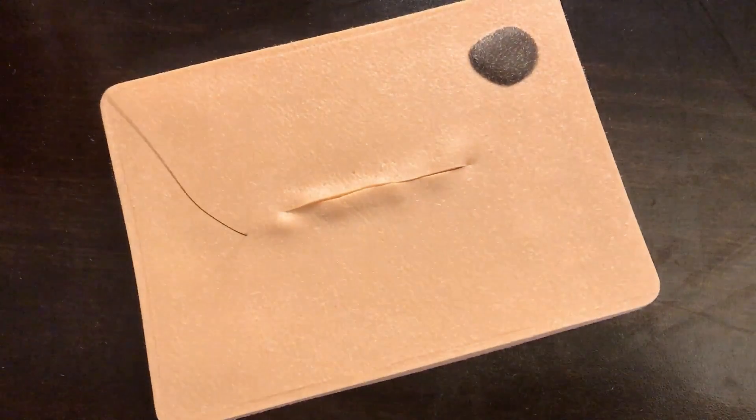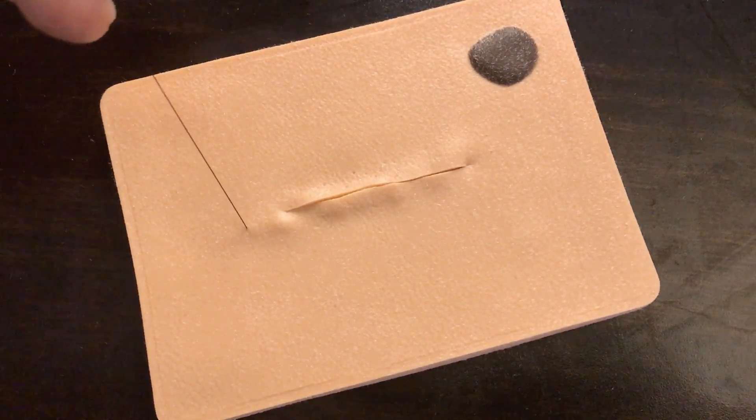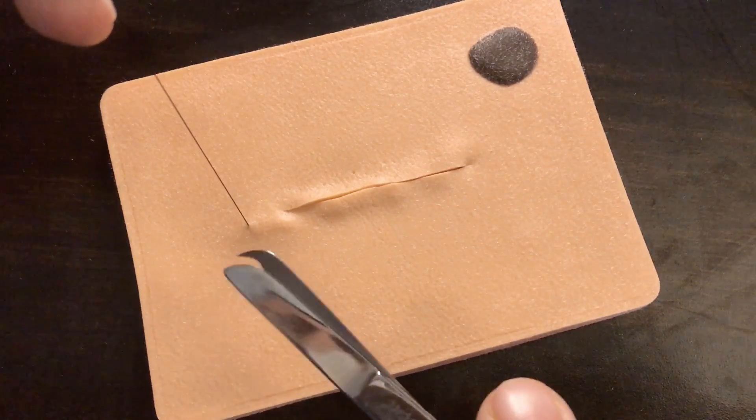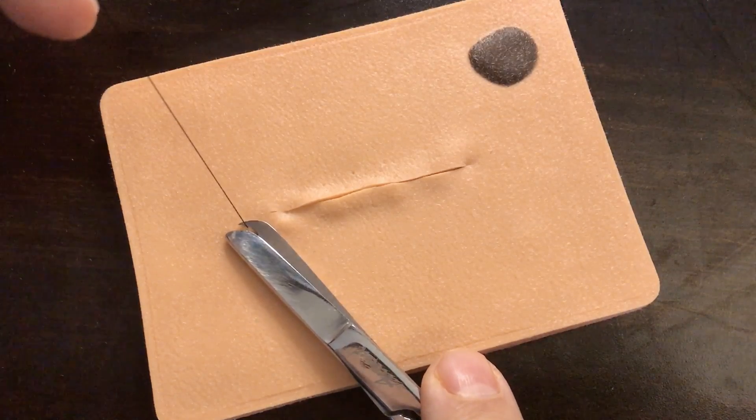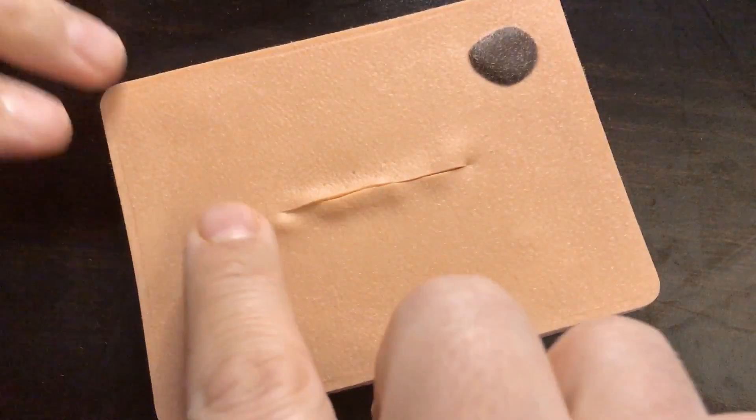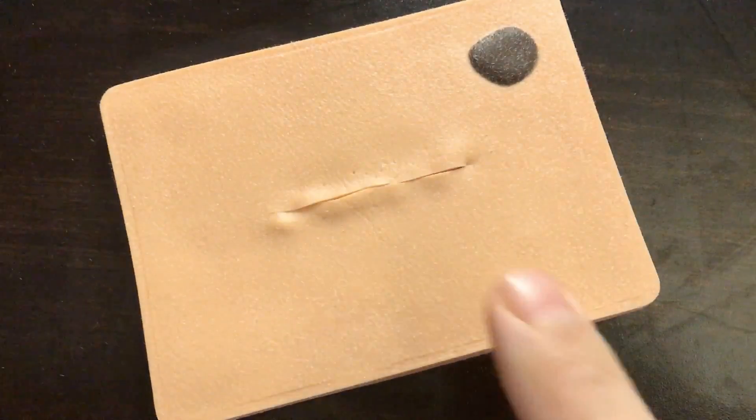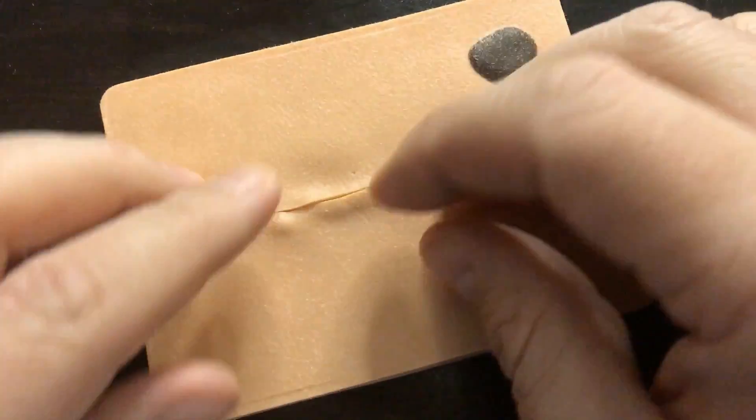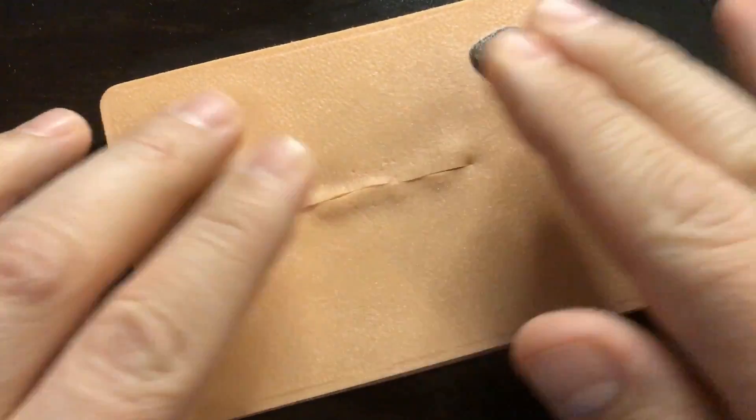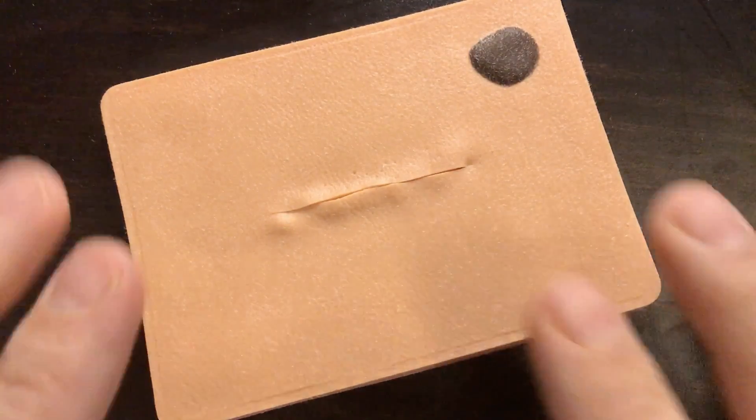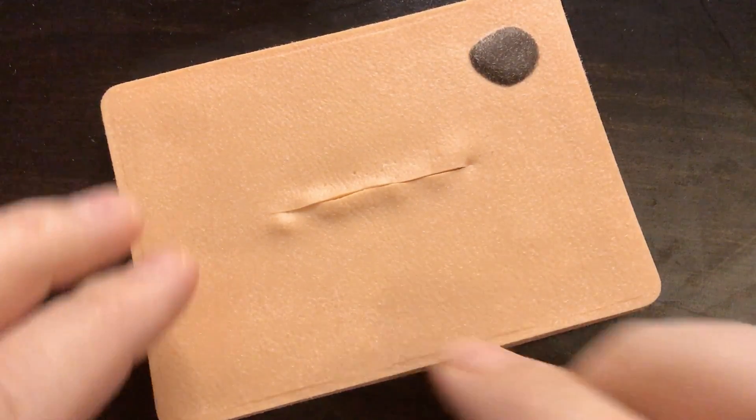So now next step then is very simple. We're just going to lift up on this suture, give it a little bit of pressure, and without being careful not to cut the patient's skin, I'm going to cut that right there. I'm going to give it a little bit of a massage so that suture buries itself under the skin because it's a dissolvable suture. It's going to dissolve over the next several weeks using the body's own inflammatory system. No need to remove these sutures.